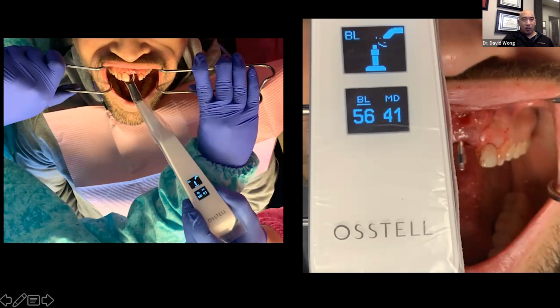So it gives you some objective information to make recommendations. So this is an example. Took out tooth number 9, implant goes in. My ISQ reads 56 and 41. So 56 buccolingually, and then 41 mesiodistally. That's low stability. That means the bone's soft, or maybe the implant's over-prepped. Anyway, it's not a good situation. So don't just put your healing cap on and leave it alone. Put the flipper or Essix retainer. You're not going to load it up.